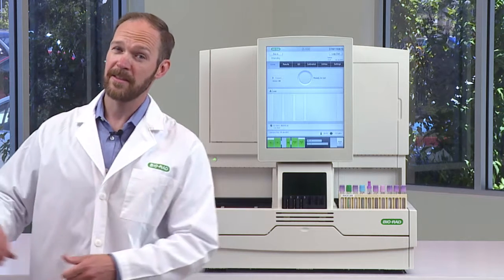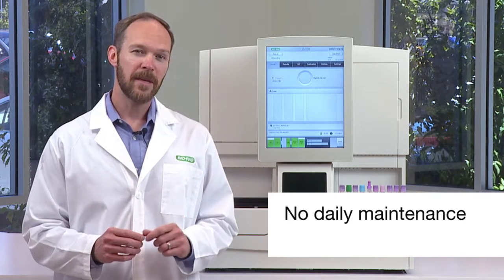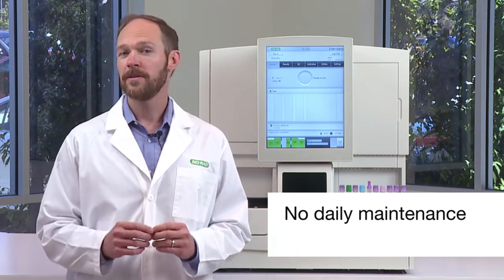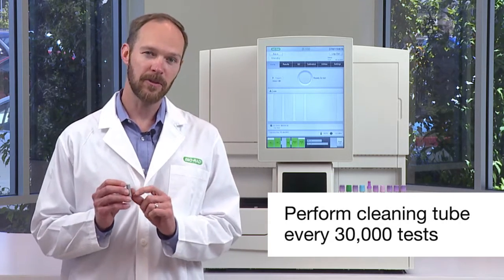Now let's talk about maintenance. For the D100, there is no daily maintenance. All you have to do for maintenance is perform the cleaning tube procedure every 30,000 tests.